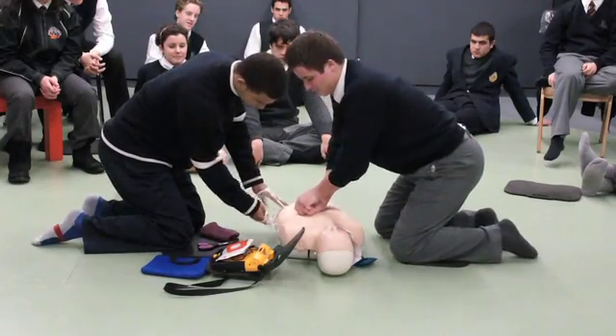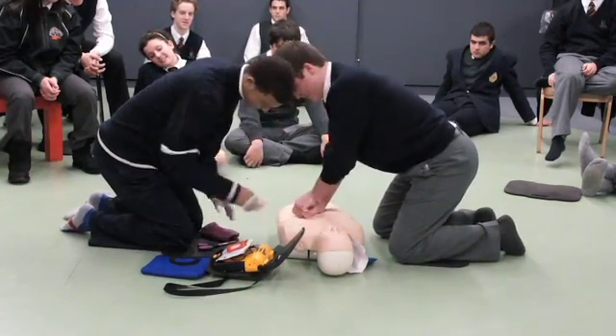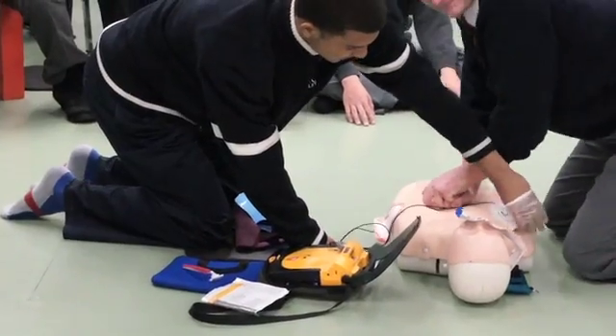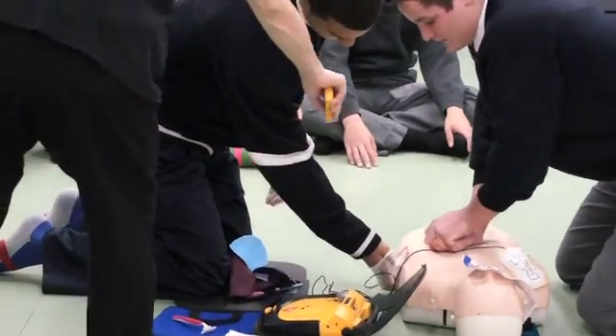Red pad further. Remove all clothing from patient's chest. Apply pad to bare skin, exactly as shown in the picture. Peel other pads off blue plastic.